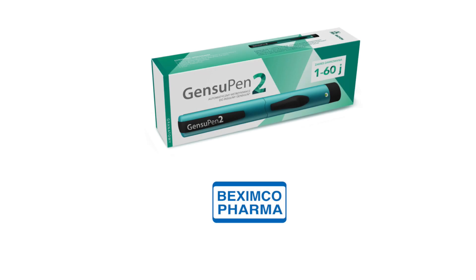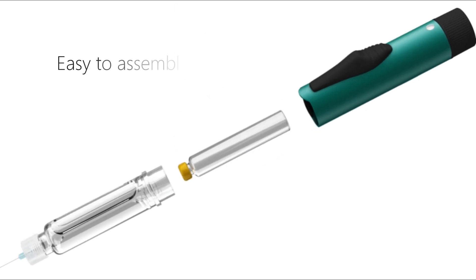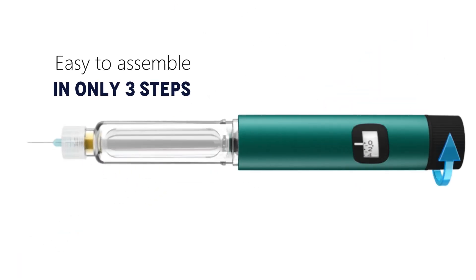GensuPen 2 by Beximco Pharma. Beximco's GensuPen 2 is easy to assemble in only three steps.